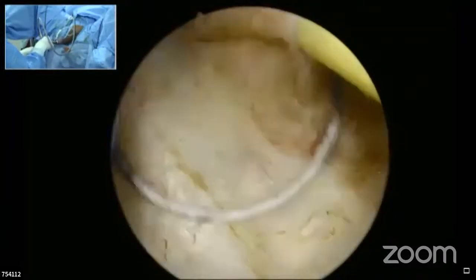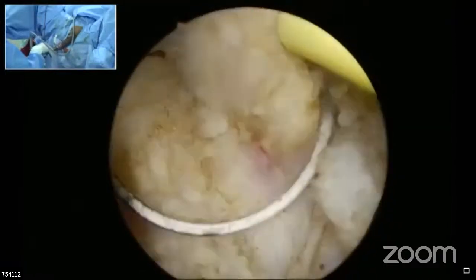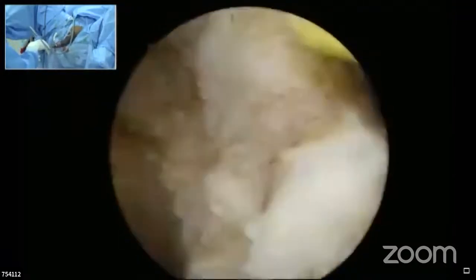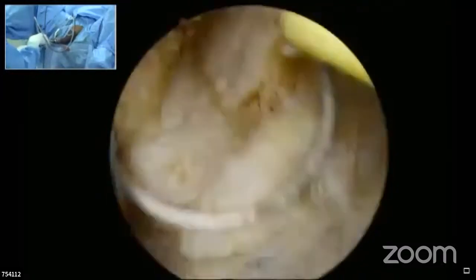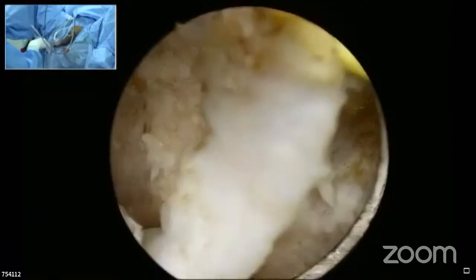There's one more question in the chat box. How to assess the verumontanum repeatedly without coming out of the scope? If you want to see the patient's verumontanum, you have to come out. It can't come in front, right?